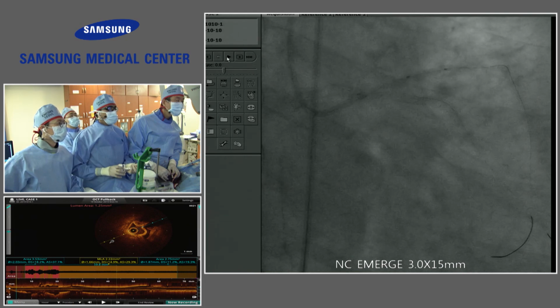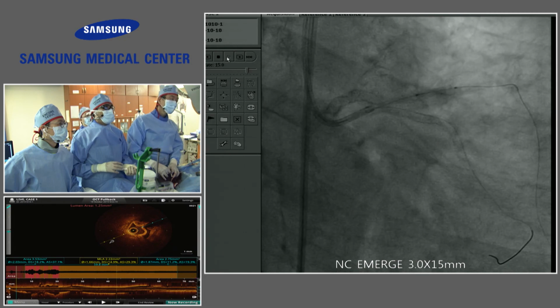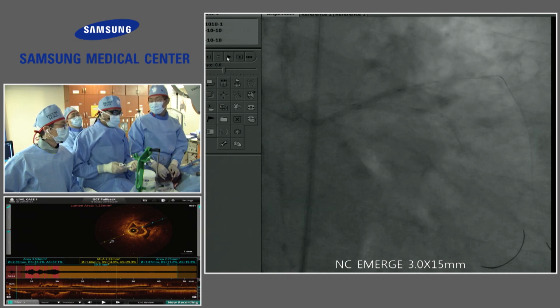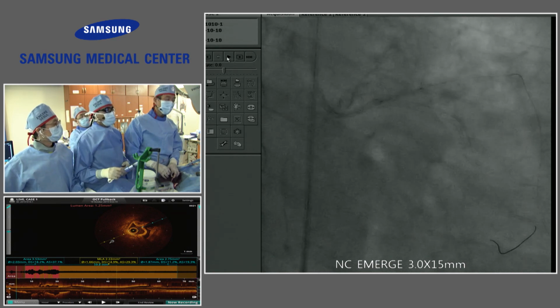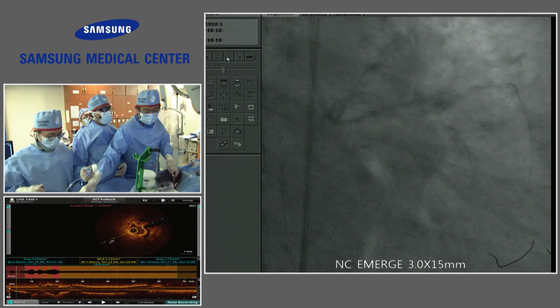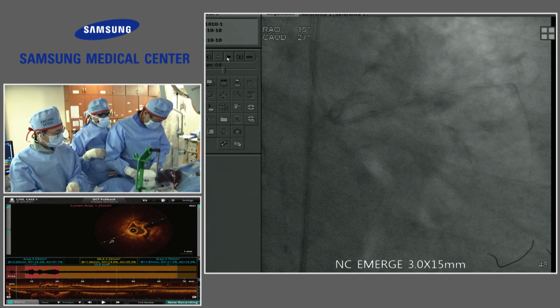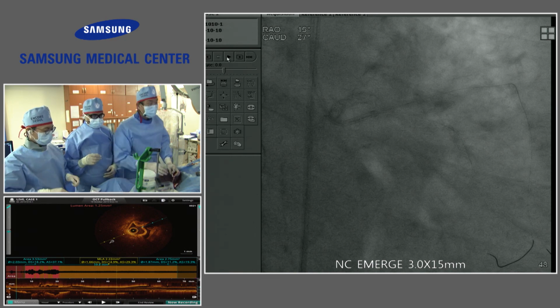I think that's a very valid, good point, especially since we now have a dissection in the LAD. I'm sorry, Dr. Ali, but next time I prefer IVUS. There was the wire on the false lumen. That's the first event, but maybe OCT can enlarge the false lumen. So yeah, that's what I feel.